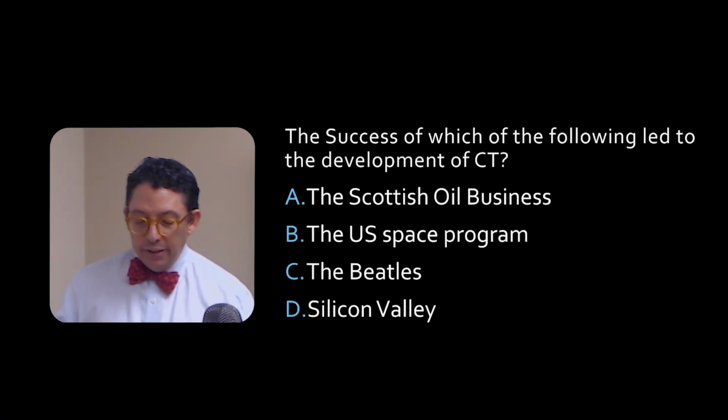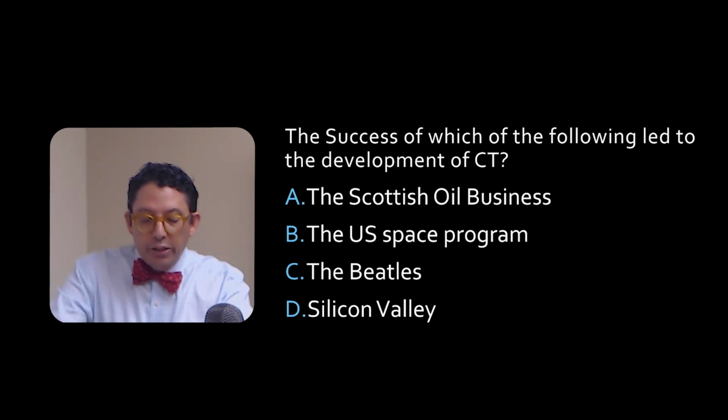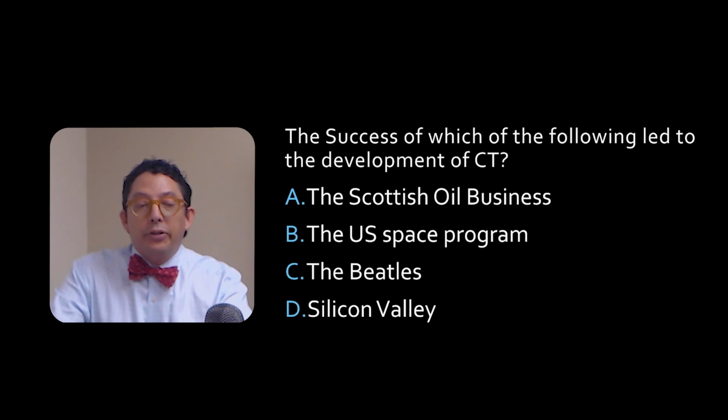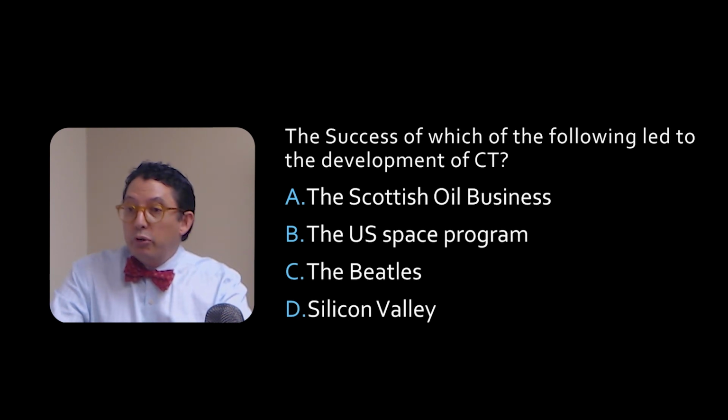So the success of which of the following industries led to the development of CT? Let's see if we know this one. Is it the Scottish oil business? Is it the U.S. space program? Is it the Beatles, the musical group? Or is it Silicon Valley?